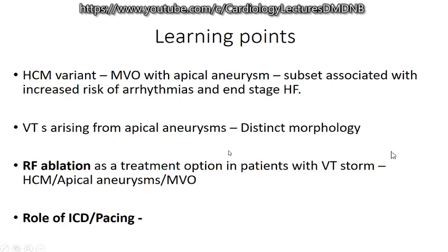An endocardial ablation or an epicardial ablation can be performed. In our patient, an epicardial ablation was done. And again, the role of non-pharmacological measures like the ICD for secondary prevention, and also the use of RV apical pacing to decrease the midventricular gradients, has been highlighted in this case. So thank you all for your patient listening.